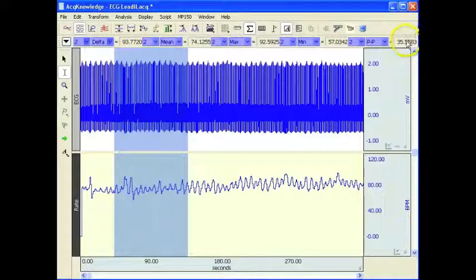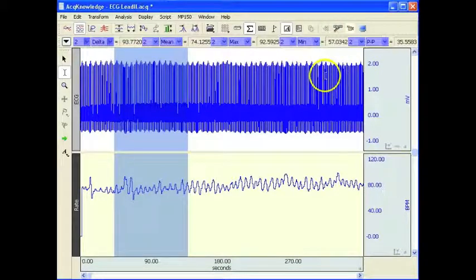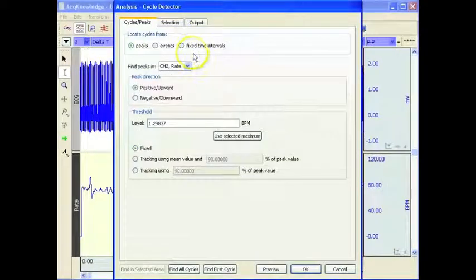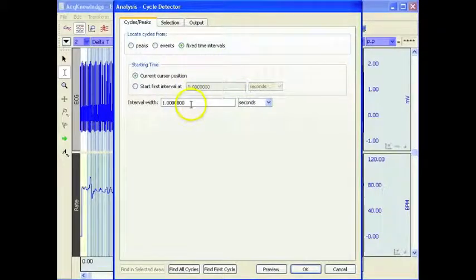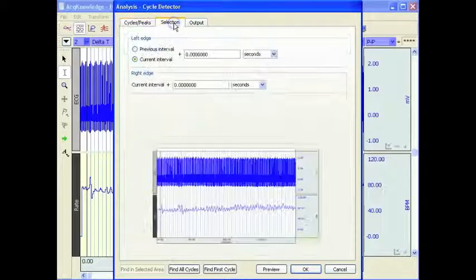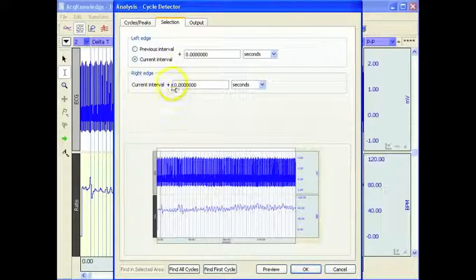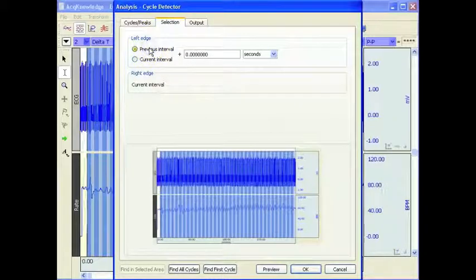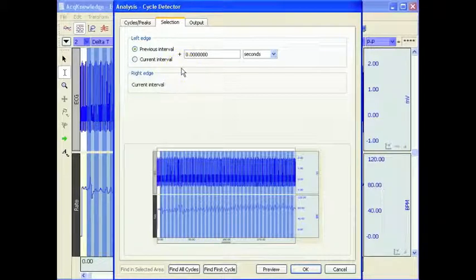The range — the difference between the minimum and the maximum — is 35 beats per minute. I'm going to set the software up so that it will take an interval of 5 seconds and go from one 5-second period to the next. Going from the previous interval to the next, you can see each shaded area represents 5 seconds.